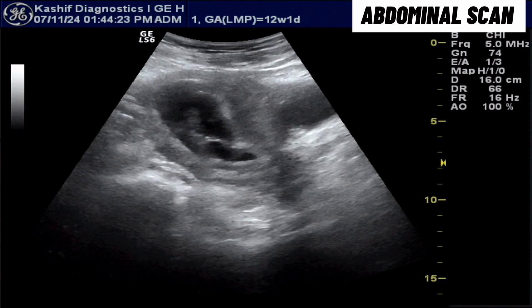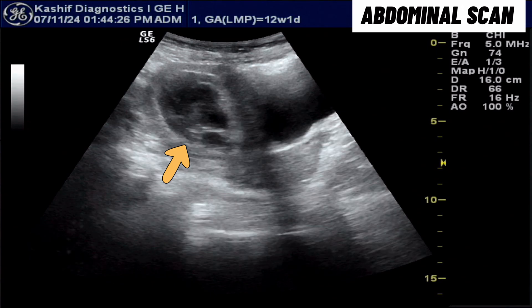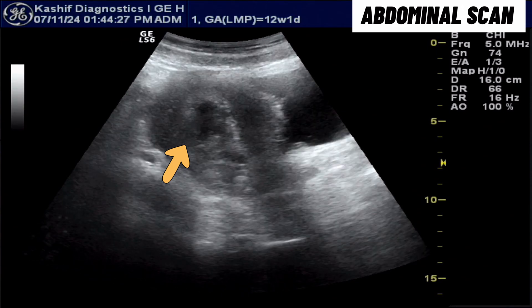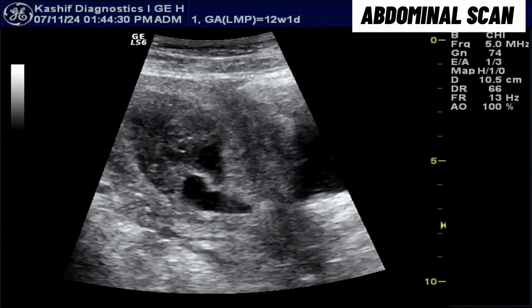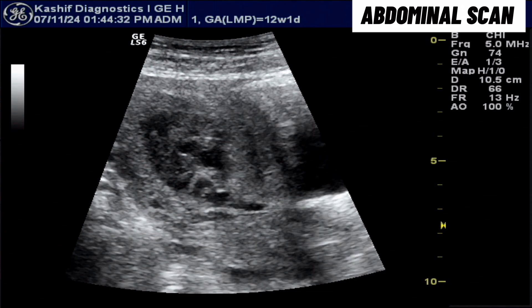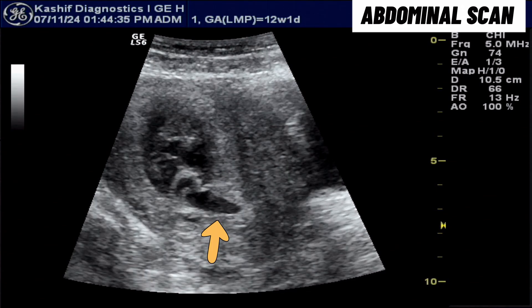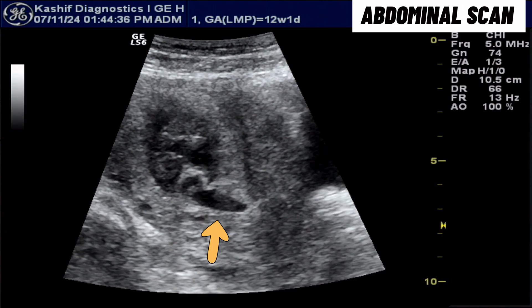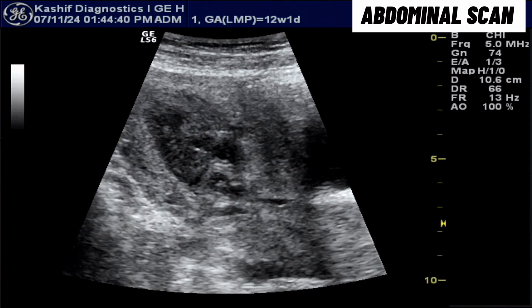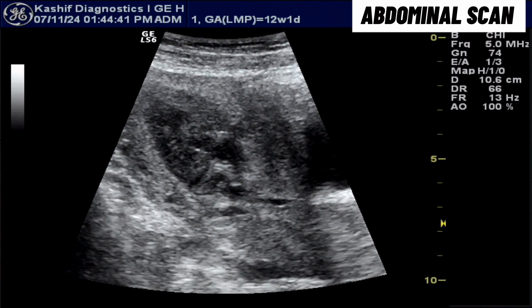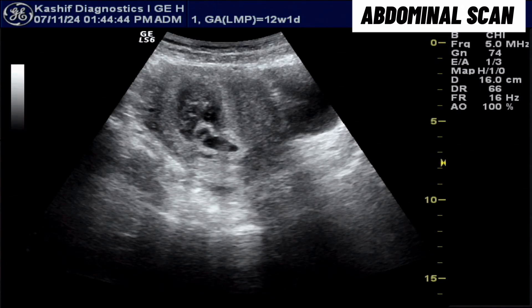An abdominal ultrasound has been performed revealing a cystic area within the endometrial cavity. This fluid with debris appears to be blood. An elongated gestational sac with small fetal pole is observed in the mid-uterine segment. Cardiac activity is not clearly visualized from the abdominal approach.